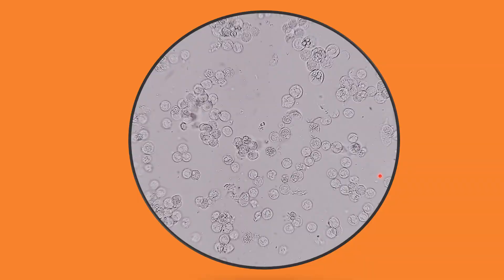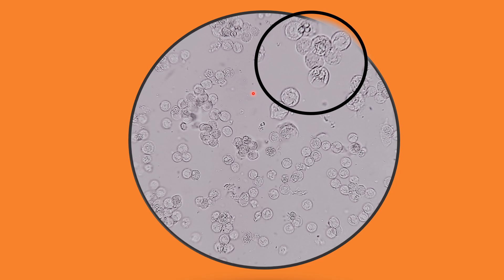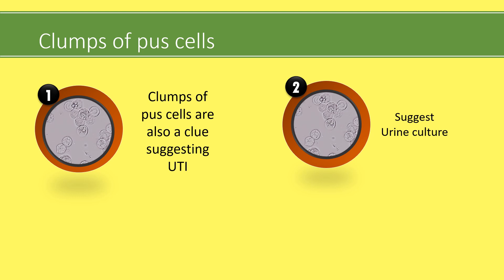In this image, notice these clumps of pus cells — can you see aggregates of WBCs together? There are also bacteria in the background, though they are too small to notice. The presence of clumps of pus cells along with bacteria is an important clue for urinary tract infection. So if we find clumps of pus cells, we should suggest urinary culture.